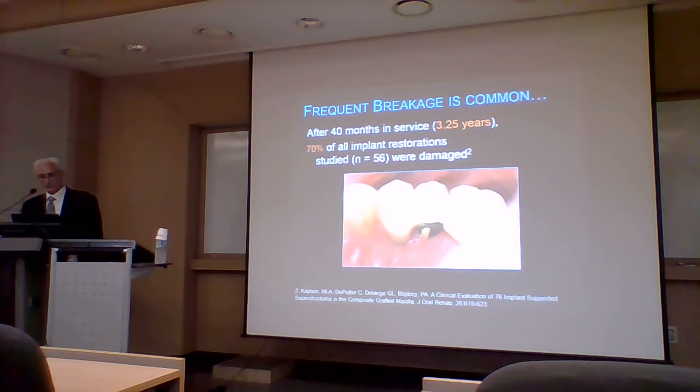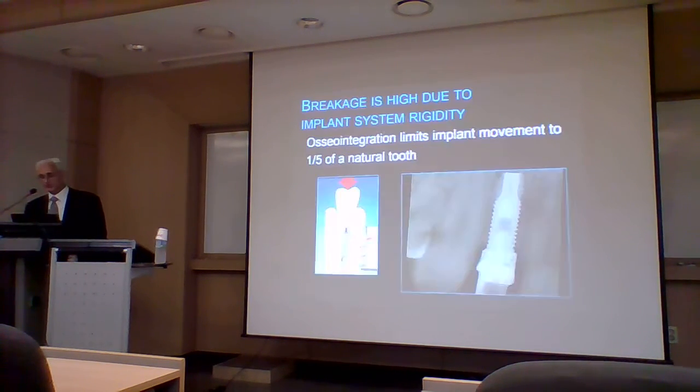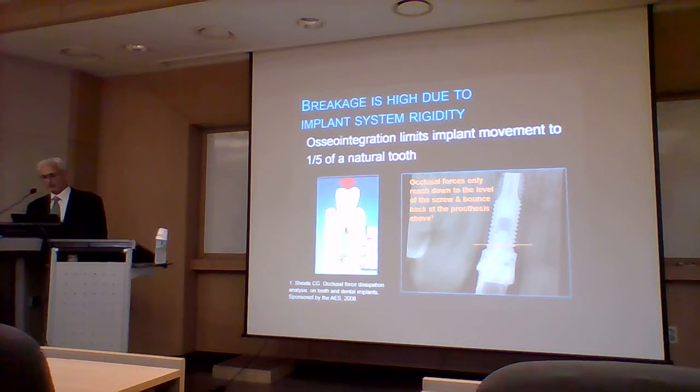This paper reported 70% of their implant restorations had some kind of breakage after three years in service. So the breakage rate is very high because of system rigidity, and studies show that the forces do not travel down the side of the implant, but they bounce back at the occlusal materials.